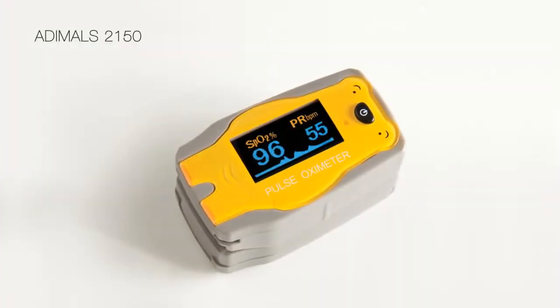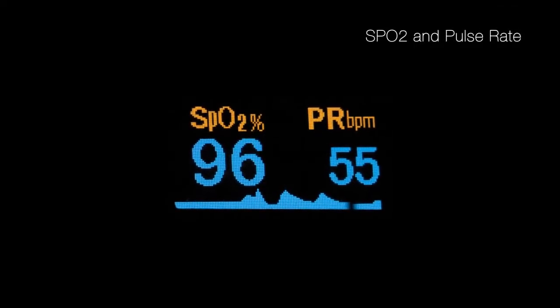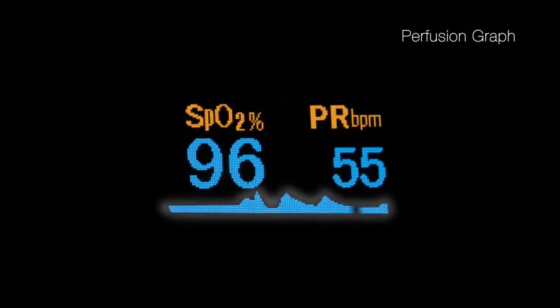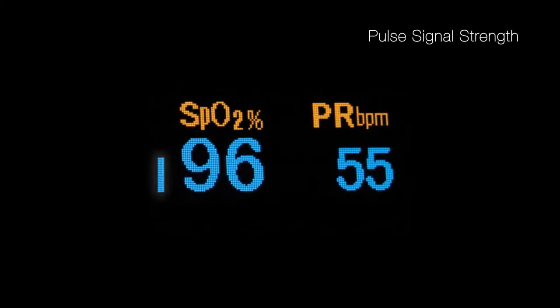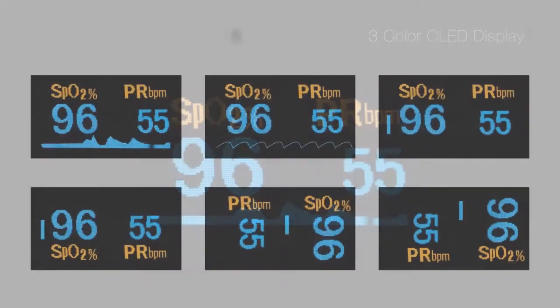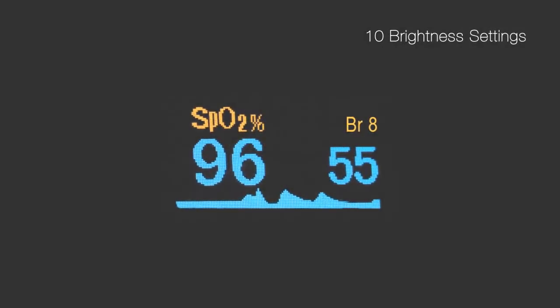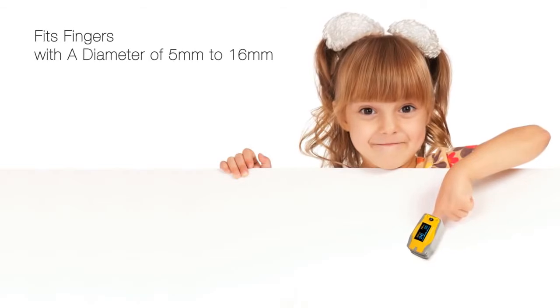The 2150, with its smaller sensor and child-friendly animal graphic, is designed for pediatric patients. Feature-rich, the 2150 provides multiple display orientations and brightness settings, and comes complete with a variety of convenient accessories.